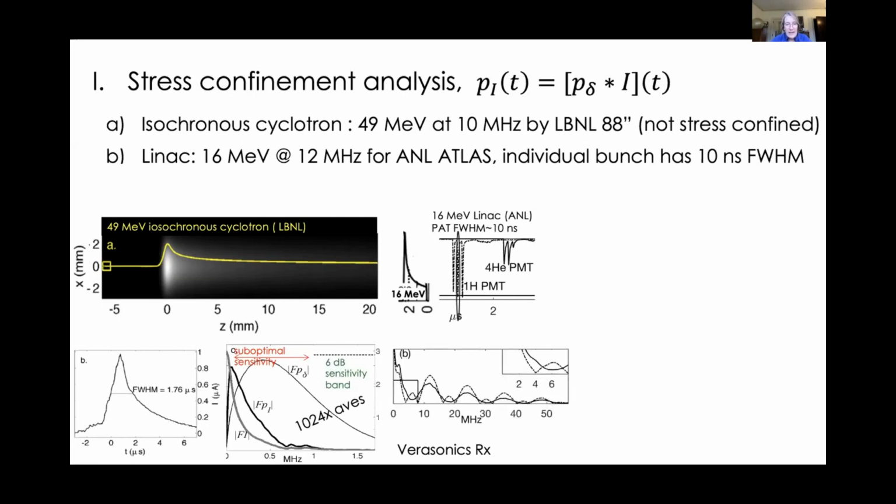And so when we did that, now you can see we are talking about the frequency being band limited to 4 or 6 megahertz, which was just about right for the P41 array that I was using with my ultrasound system. And we could also, because we tuned now to the receive sensitivity of our acoustics system, we could detect a single pulse rather than having to average over 1,000.